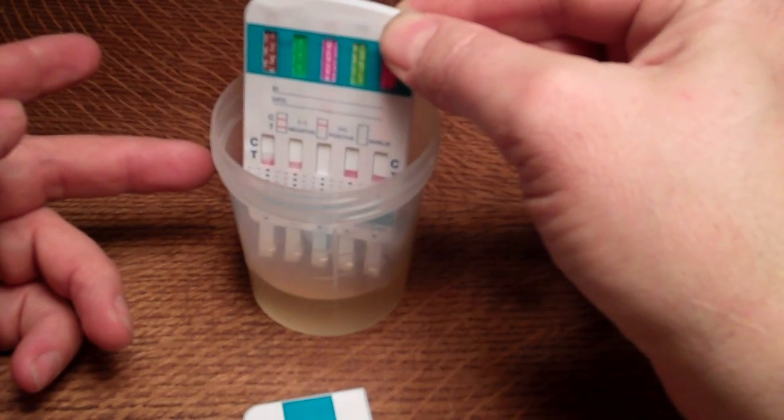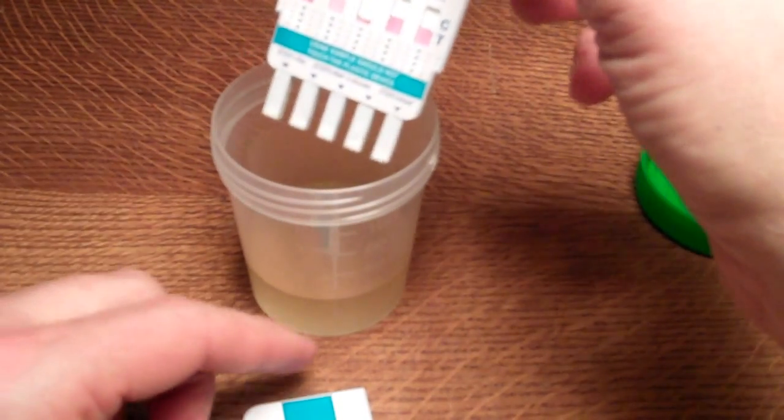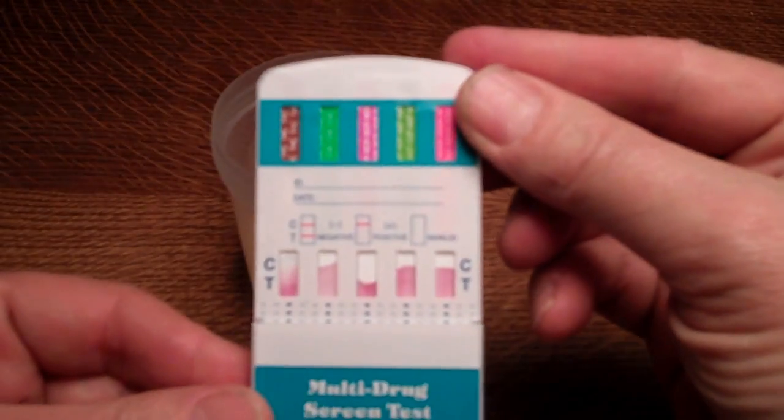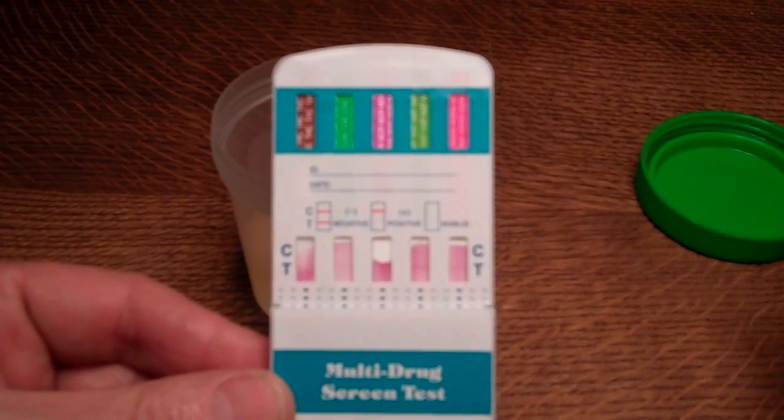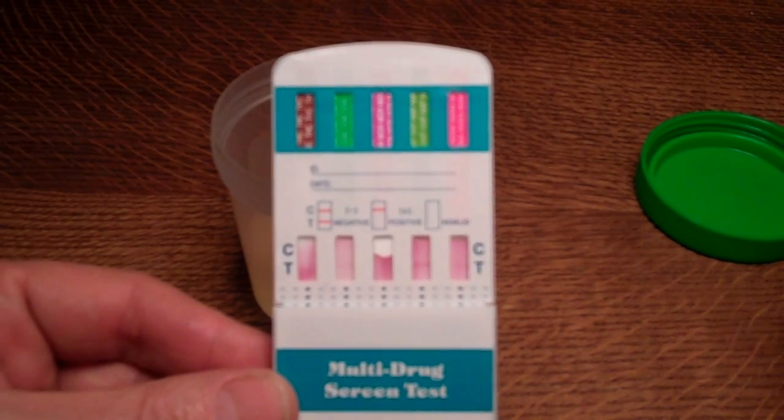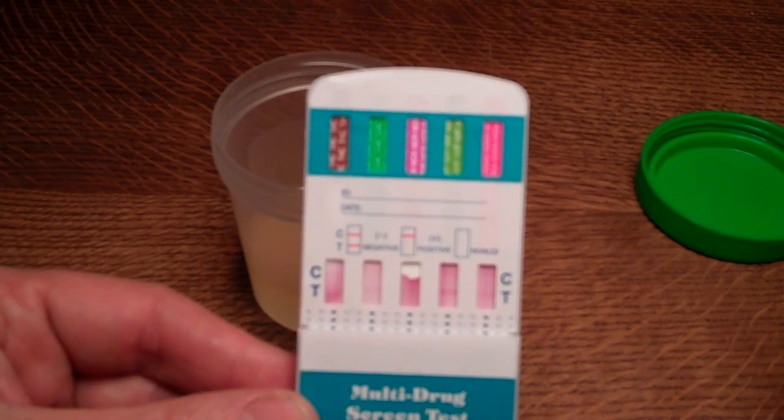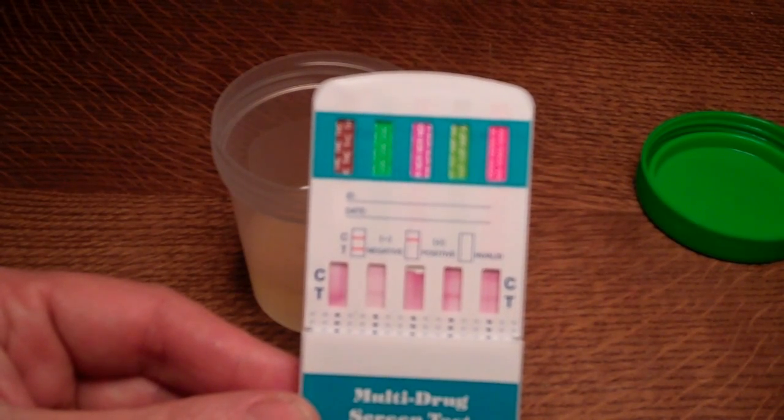A good indicator that you've dipped it for sufficient time is that you can start to see the dye running up in the test windows. So I'll just give that a little shake, reapply the cover at that stage, and what we'd normally do is lay this on a flat surface and wait for the test membranes to run. But I'm going to hold this in front of the camera because there's perfectly enough osmotic pressure to run these test membranes with them being held on an angle like this.